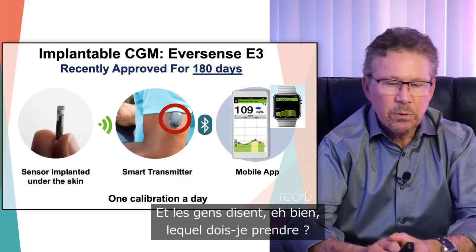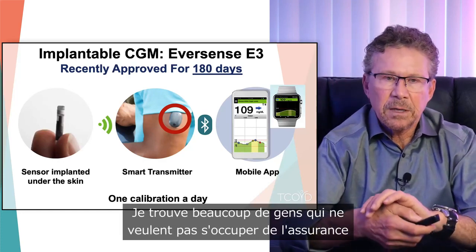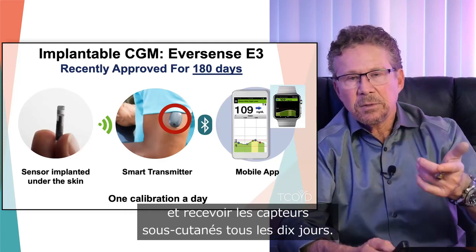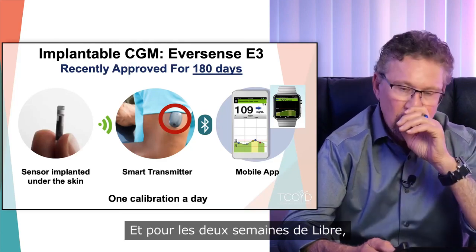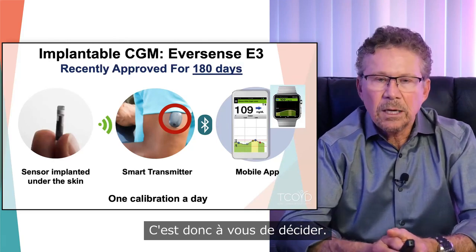And people say, well, which one should I get? I say, it's personal choice. I find a lot of people just don't want to deal with the insurance and getting the subcutaneous sensors every 10 days, and for the Libre 2 weeks. Others are in the water a lot, etc. So it's totally up to you.